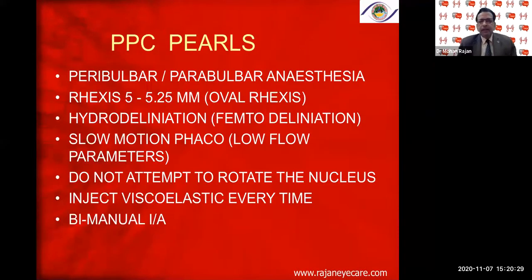If plaques are very, very thick, then it's better to remove them on the table than to do a YAG capsulotomy. It's very difficult to do the YAG laser because it involves a lot of energy, and a lot of pitting of the lens can also occur.